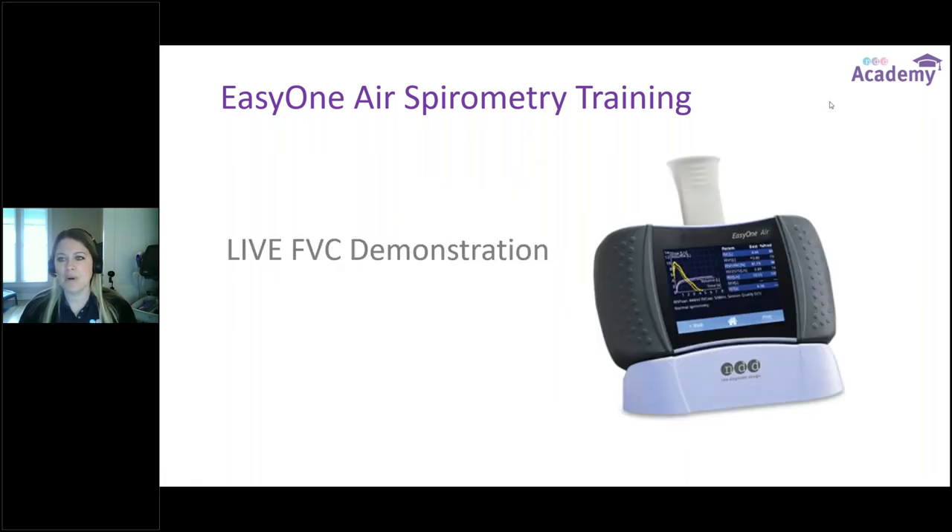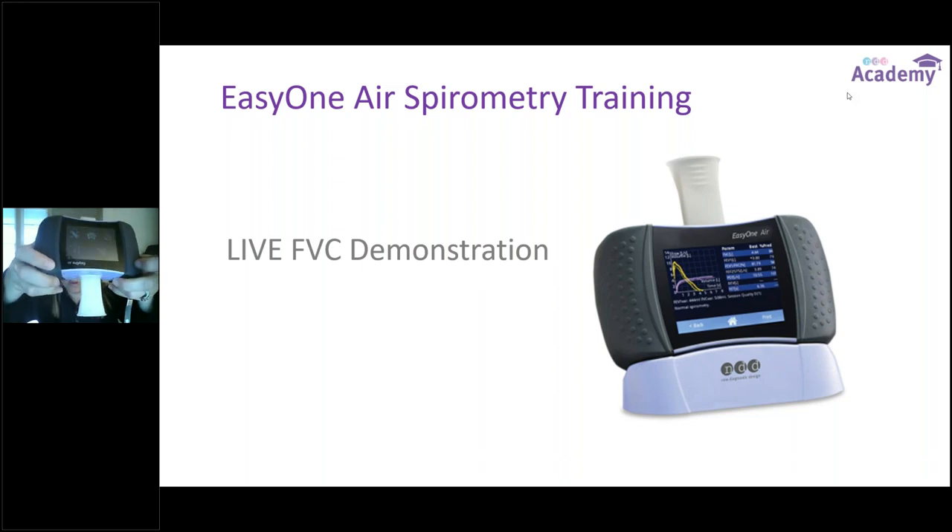I'm going to take down my slides and do an FVC maneuver on the device. The first thing I do is insert the flow tube into the EasyOne Air device, lining up arrow to arrow, making sure it's inserted all the way. I'll select myself as the patient and select to do an FVC maneuver. At the beginning of all FVC tests, it asks you to block the flow tube — this gives the point-to-point ultrasound a moment to zero out. You can use a gloved hand or leave the plastic wrap on for this quick self-check.